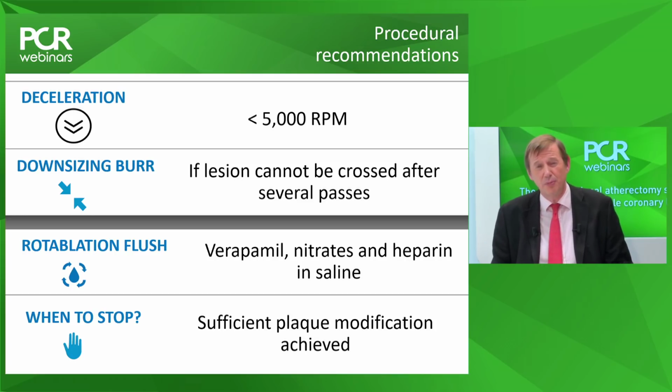And we stop when we think there's sufficient plaque modification, and that is based on the use of a balloon inflation to decide whether or not we should be able to get our stent in. So for the last part of the webinar, we're going to have a focus on complications.